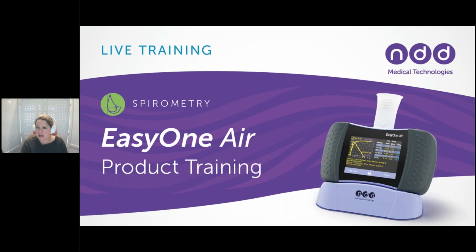So I am going to stop sharing my screen here for just a moment. And I'm going to talk a little bit about the EasyOne Air spirometer. And you'll have to excuse me for just a second. GoTo has rearranged my things just a little bit. There we go. So I was missing my camera view here for just a second.